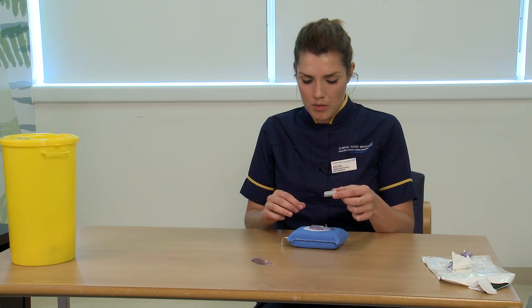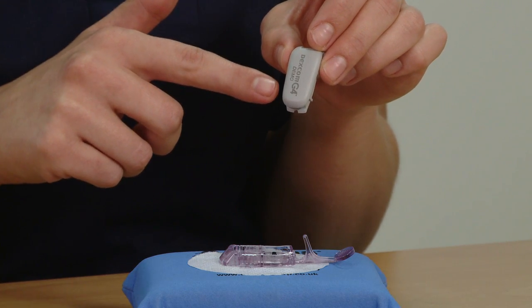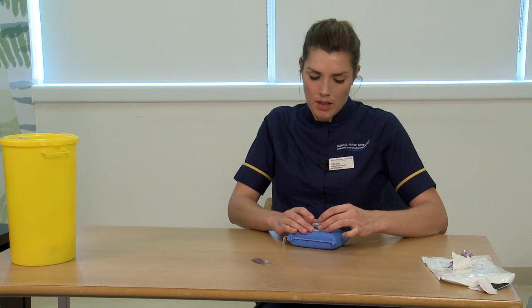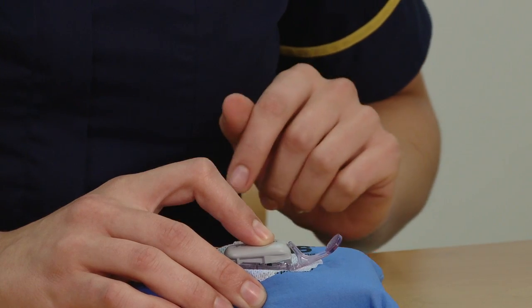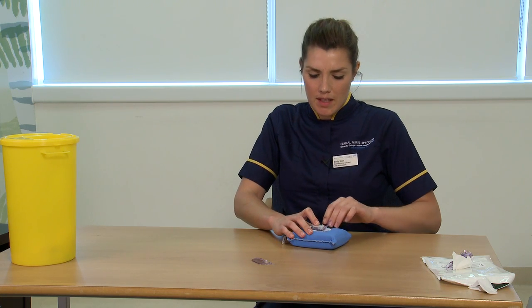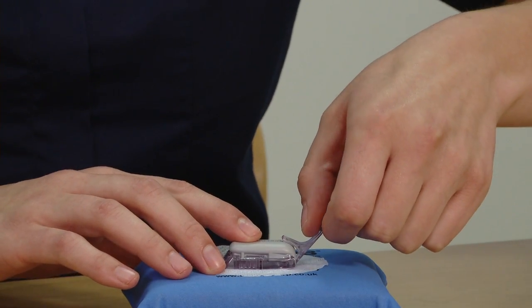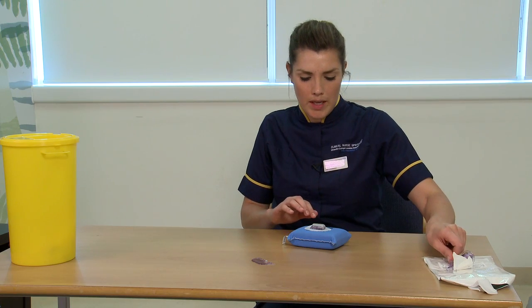Take the Dexcom transmitter and insert the slimmer end away from the transmitter latch — just slip that in there. Now, support around the skin and using your finger, push down firmly to clip the transmitter into place. You'll see that the transmitter latch has popped up, so twist and pull that away to remove it.